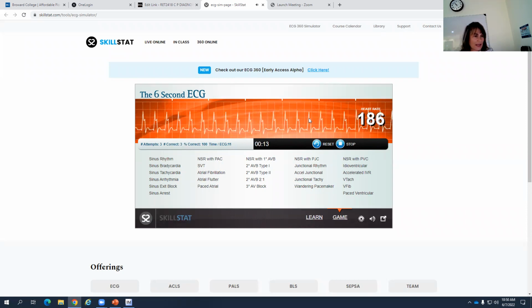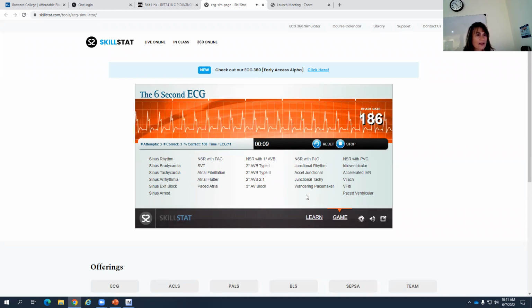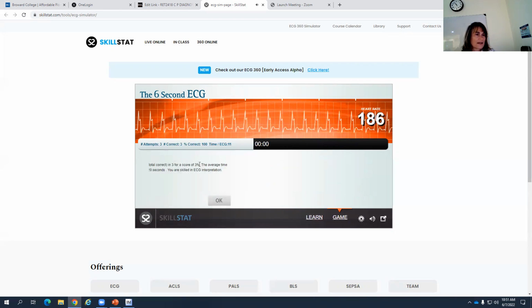Yes. Okay, is that one of the options? Maybe junctional tachycardia or SVT? SVT? Oh, it is, yeah. I don't know if it was SVT or junctional.